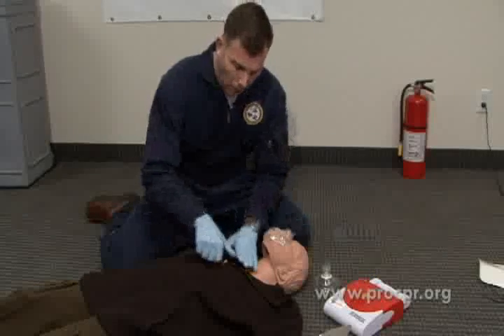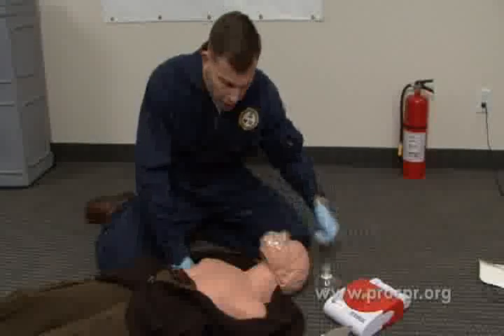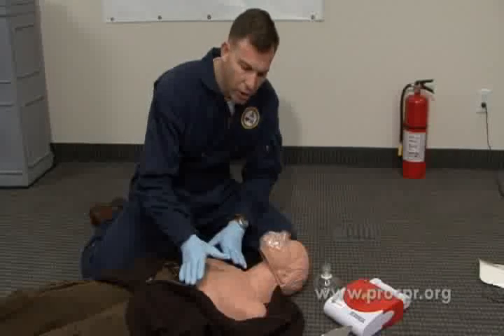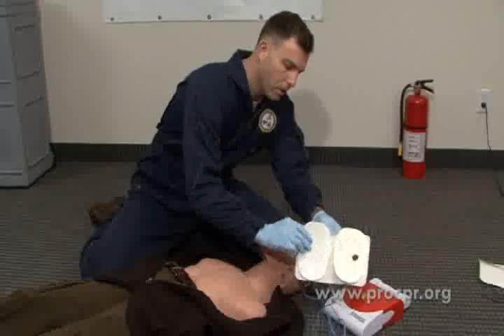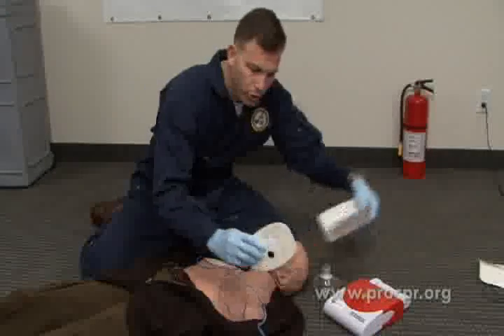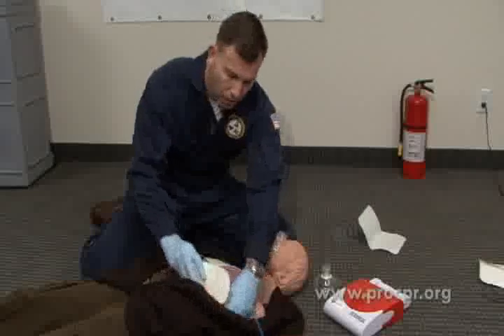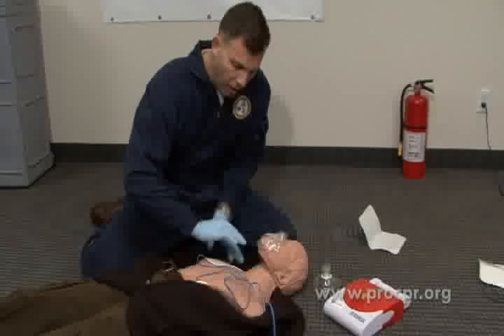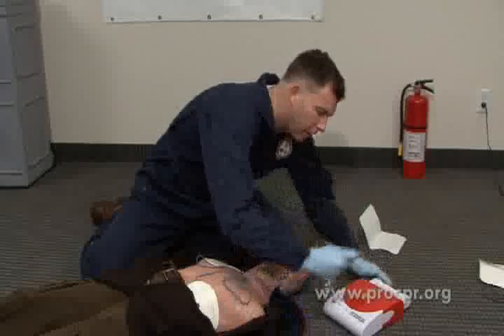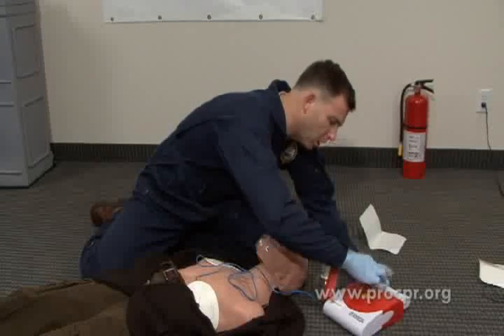Remove clothing from person's chest. If there's any wetness on the chest or nitro gel patch, we're going to wipe that off. Attach pads firmly to person's chest, as shown. We're going to go ahead and attach these pads as it shows you a diagram on the pads, the proper locations, above the right breast, below the left breast, mid-axillary. Check connector and pads. We're now going to plug in the connector.